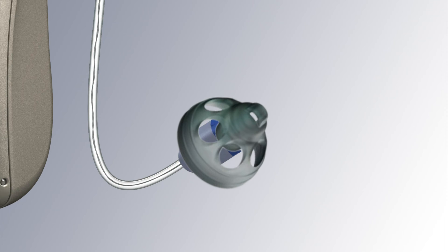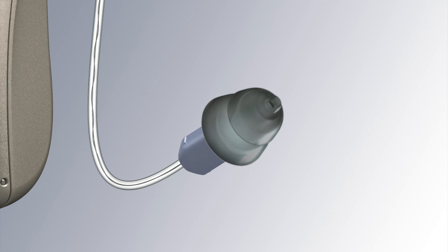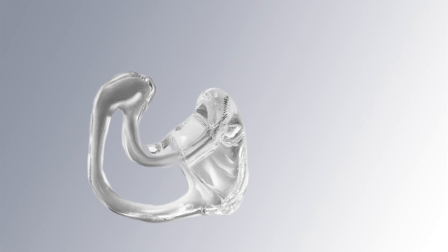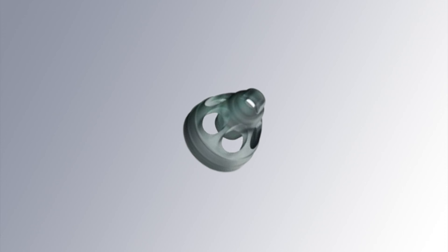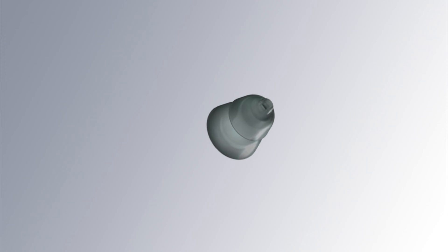Its ability to fit different ear sizes and shapes is due to the swappable rubber domes, which is what is inserted into the ear canal. Custom ear molds can even be used instead of rubber domes with this hearing aid style. That said, rubber domes are by far more popular than custom ear molds, not because they're always better, but because they're much easier to fit in the ear canal quickly.